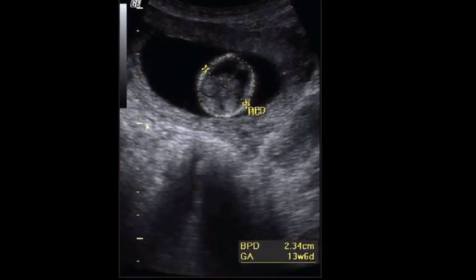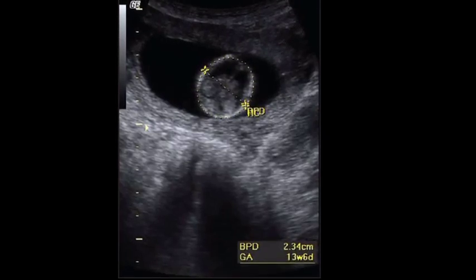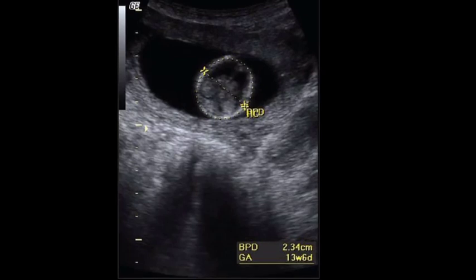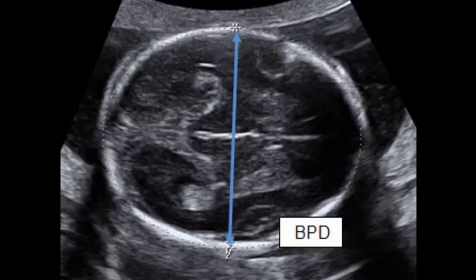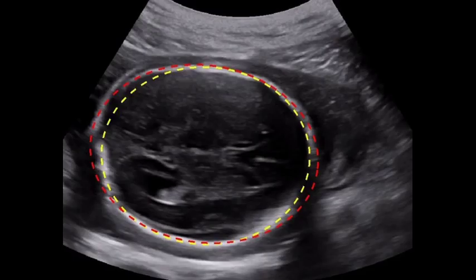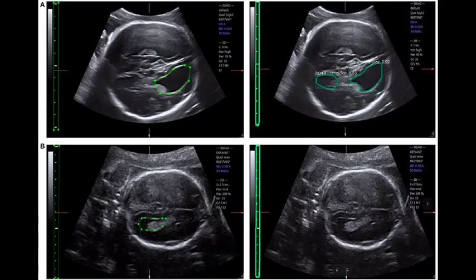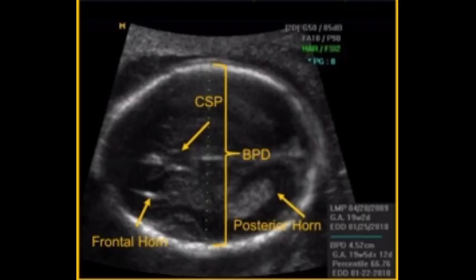The biparietal diameter is useful for dating a pregnancy and in estimating intrauterine fetal weight in weight equations. The latter has the advantage that all three measurements — biparietal diameter, head circumference, and ventricular atrium — can be taken in the same section. The calipers should be placed at the widest part of the skull, perpendicular to the midline echo. Other than that, its value is limited and can sometimes be misleading in the assessment of fetal growth if it is the sole measurement taken for interpretation.